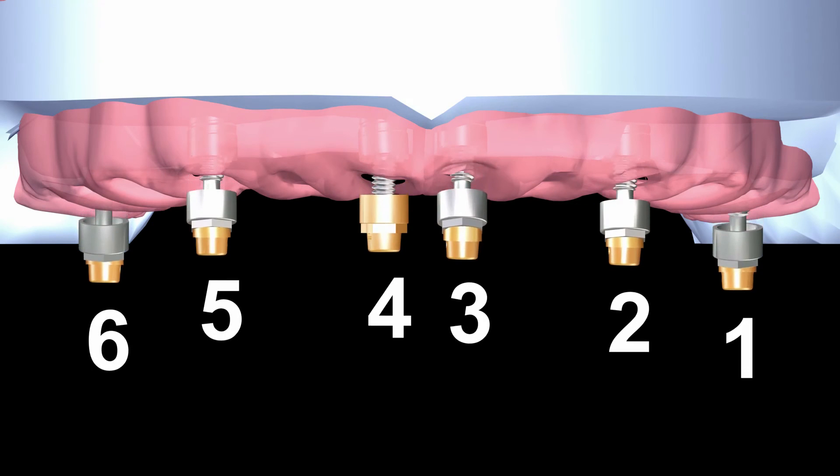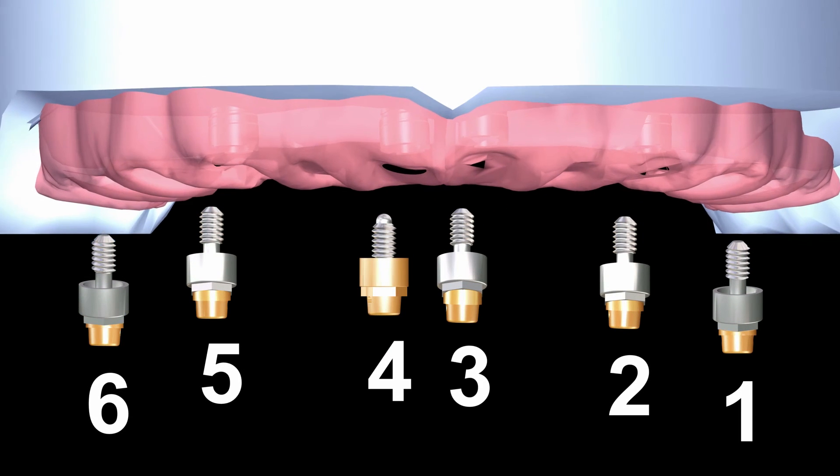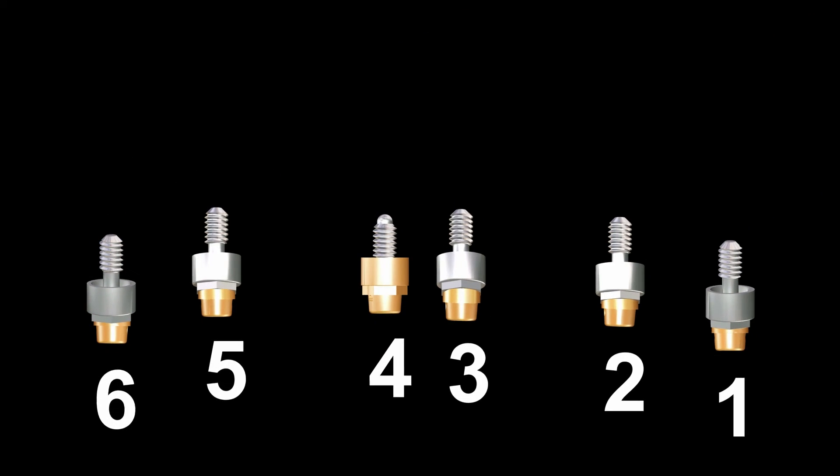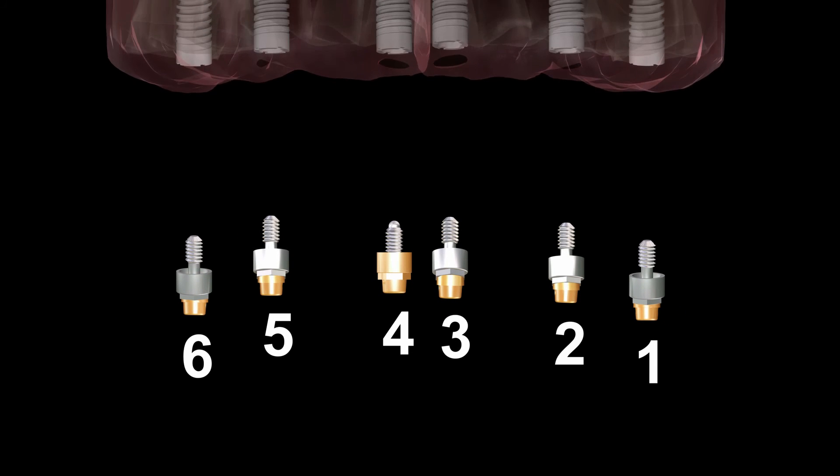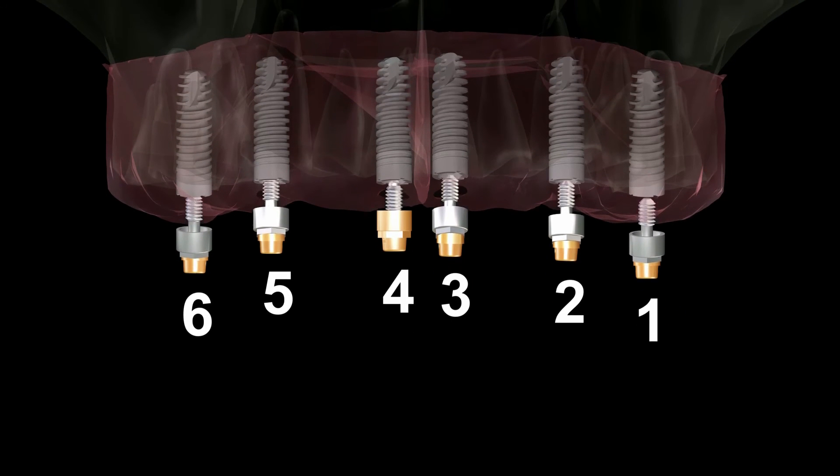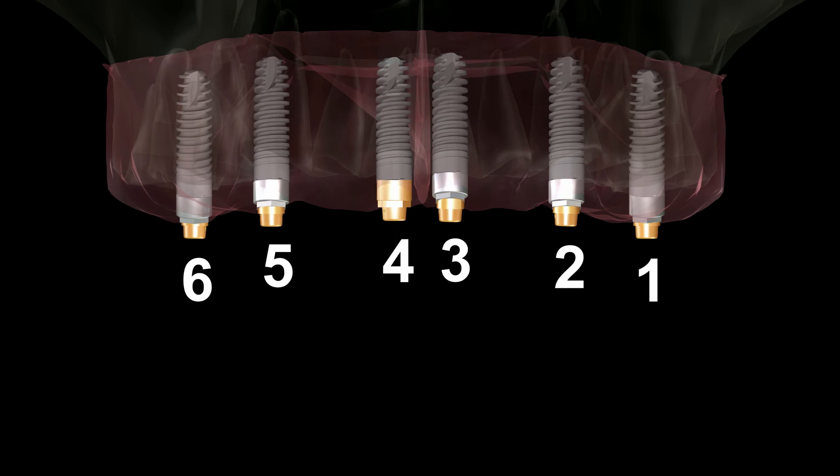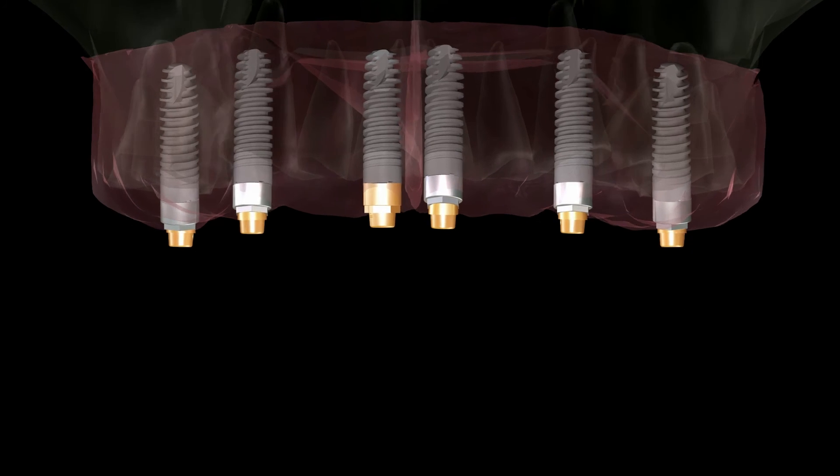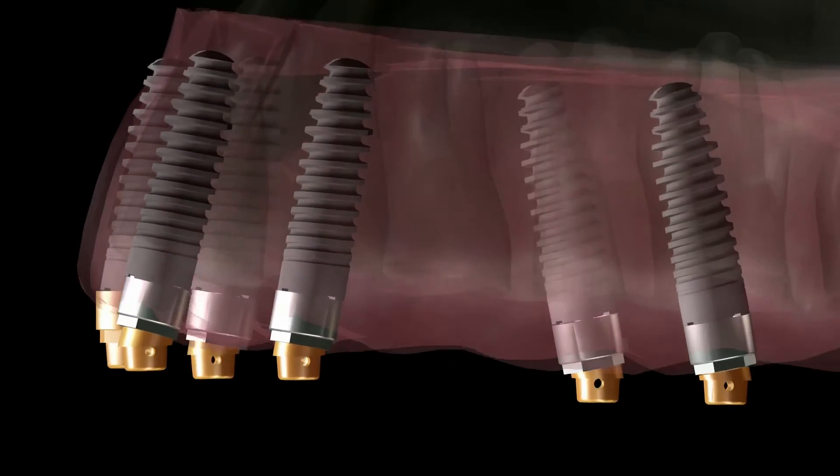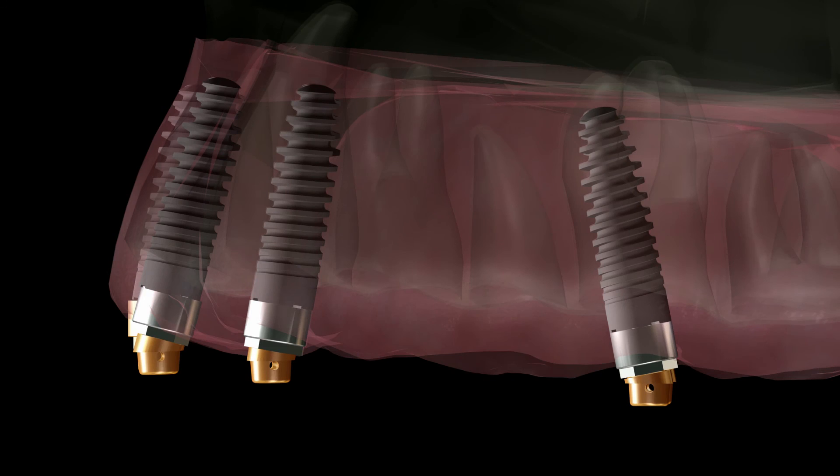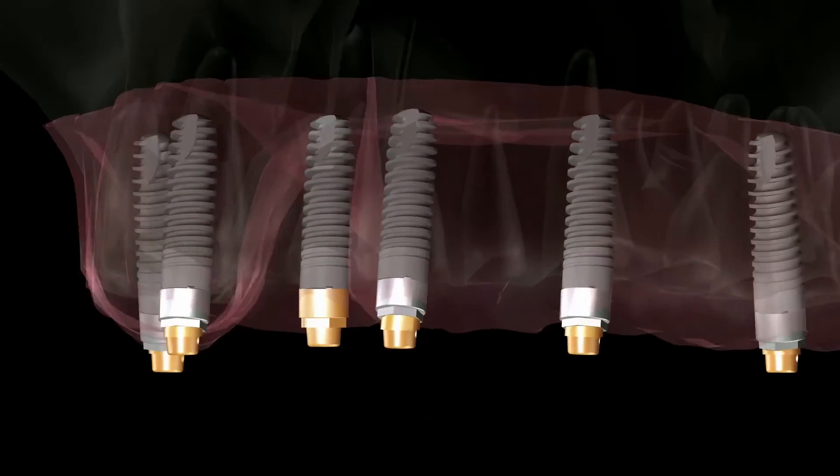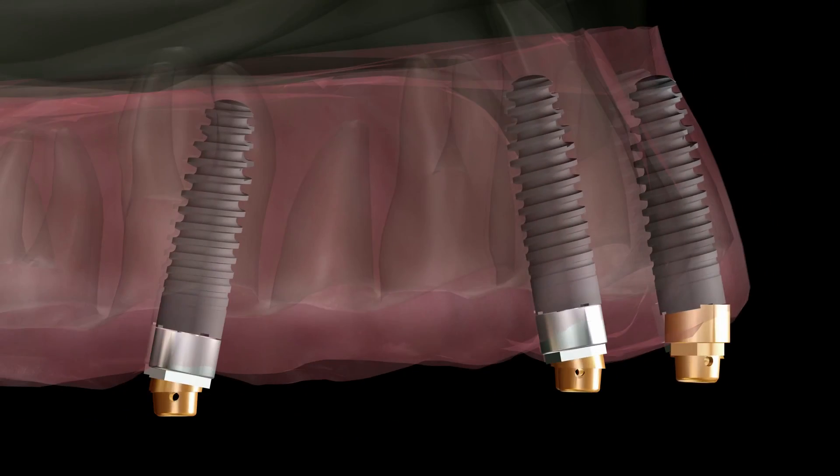It is best to unscrew each abutment from the model, one at a time, to be sure that they are transferred into the correct implant and tightened to 20 newtons of torque. When observed from several angles, it is apparent that all the ERA attachments are optimally parallel so that the insertion of the overdenture is easy and the males can provide a longer life.